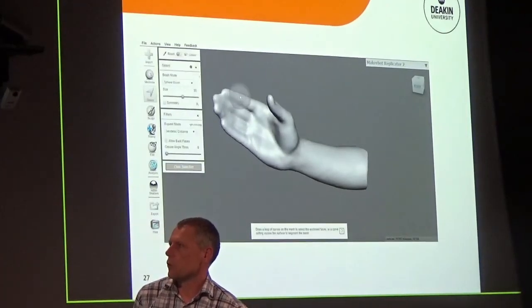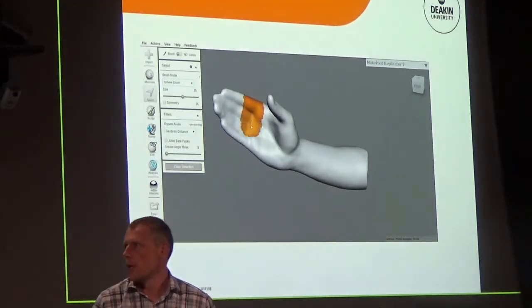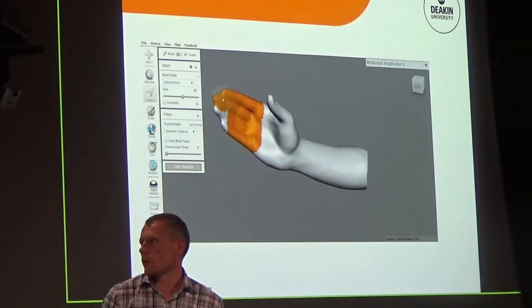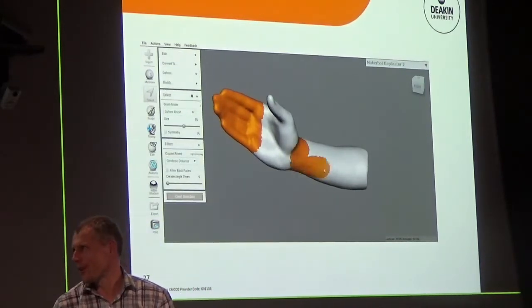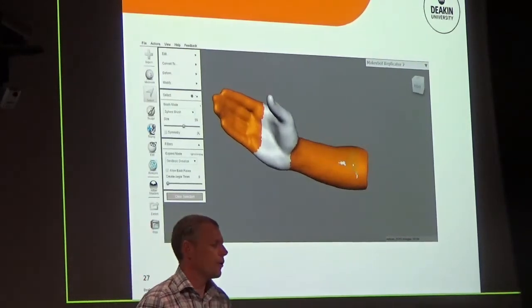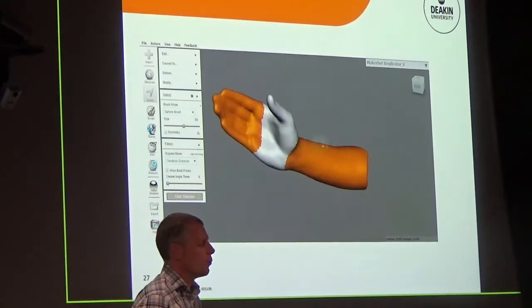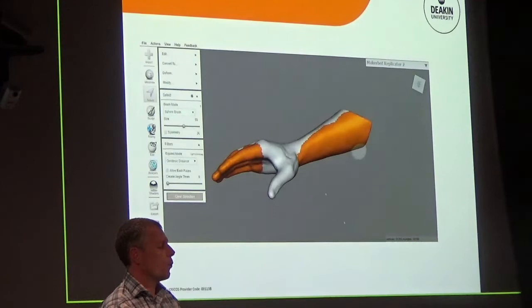And then you've got different tools that you can use. And again, this takes a little bit of practice, a little bit of effort, but it's not significant. A bit of painting there. Just doing the same again. So using this software, you've got the ability to keep things, smooth edges, you've got the ability to remove parts, and you've got the ability to highlight or smooth out rough edges and any spots that might not have scanned properly.